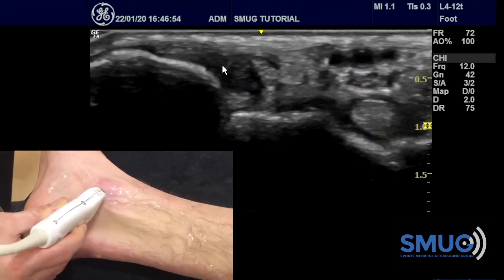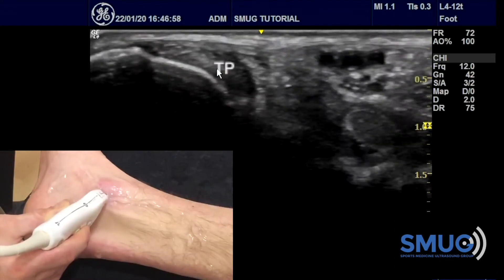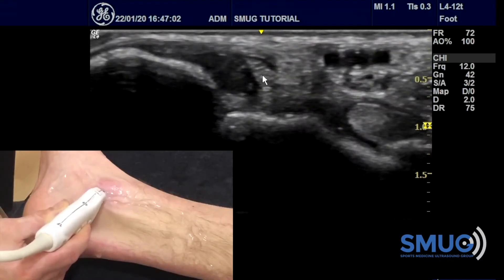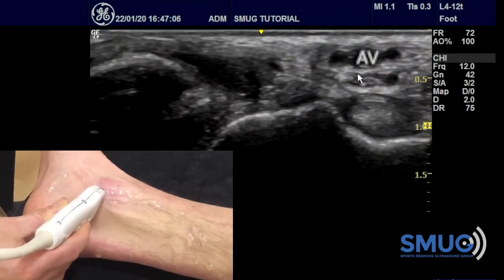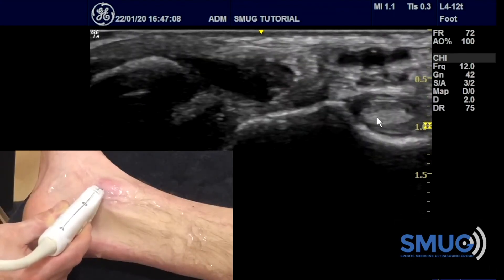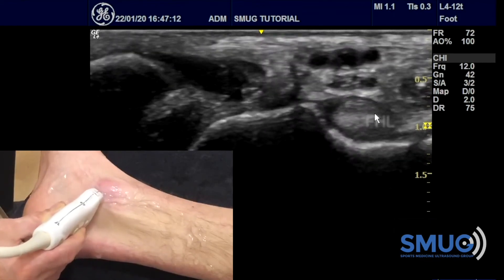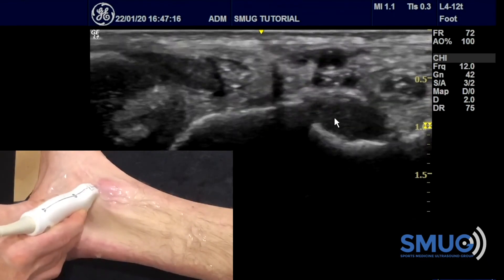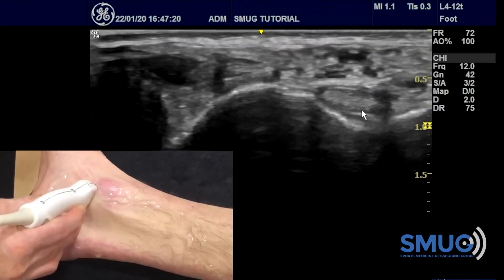Within one picture you get all these structures, and once you have them you can trace them distally and proximally. We refer to this as Tom, Dick, and Harry: Tibialis posterior, flexor Digitorum longus, then the Arteries and veins, the Nerve, and then flexor Hallucis longus. Once you can see a tendon of interest and have your landmark, you can spin on it, go distal and proximal, and be confident you're on the right spot.